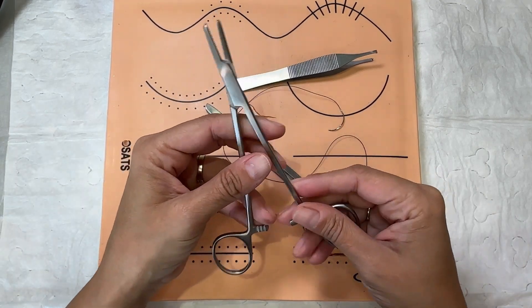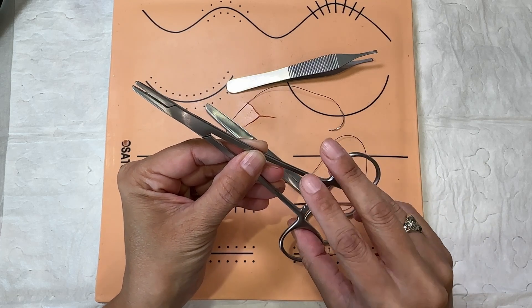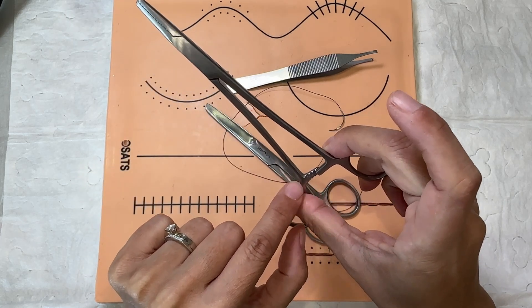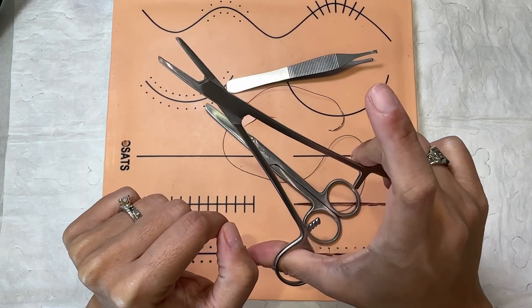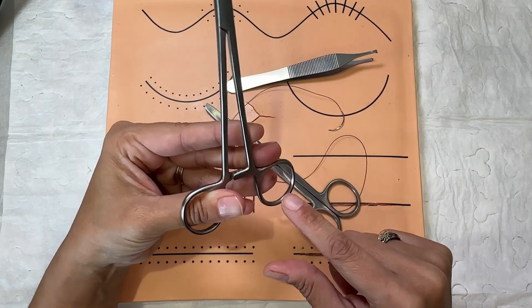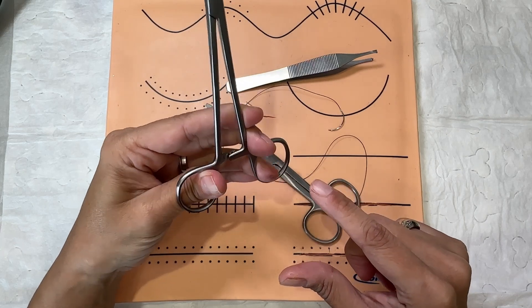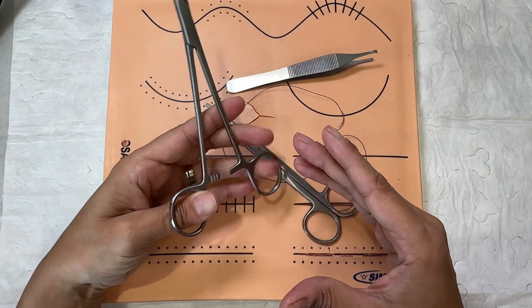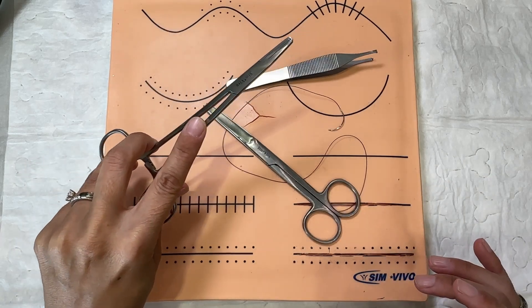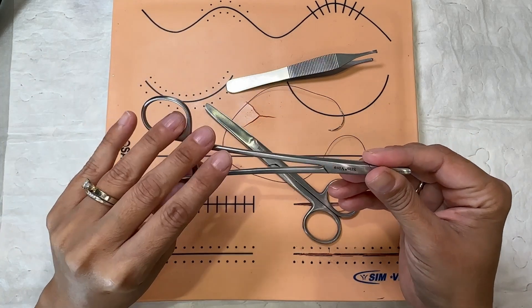Let's start with our needle holder, our needle driver. Traditionally with the right hand, we put our thumb in here and our fourth finger in here. When the locking mechanism engages, we push forward with our thumb and pull with our fourth finger to disengage. Now with the left hand, it's opposite because the locking mechanism works differently — you pull with your thumb and push with your fourth finger to unlock it. My recommendation is practice. While you're studying, get a pair of needle drivers and just practice opening and shutting. You don't want to stick your fingers in too far, and keep the first finger on top, just like you would with the right hand.